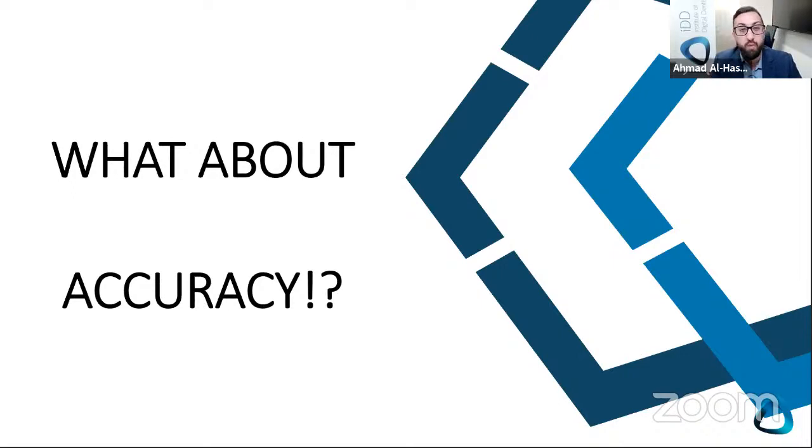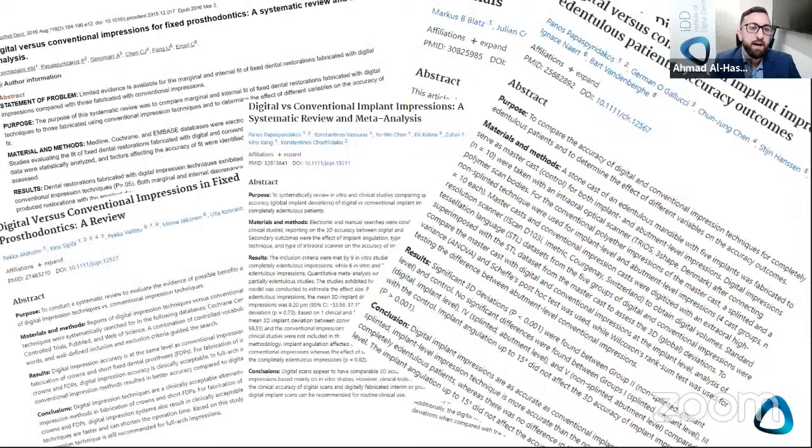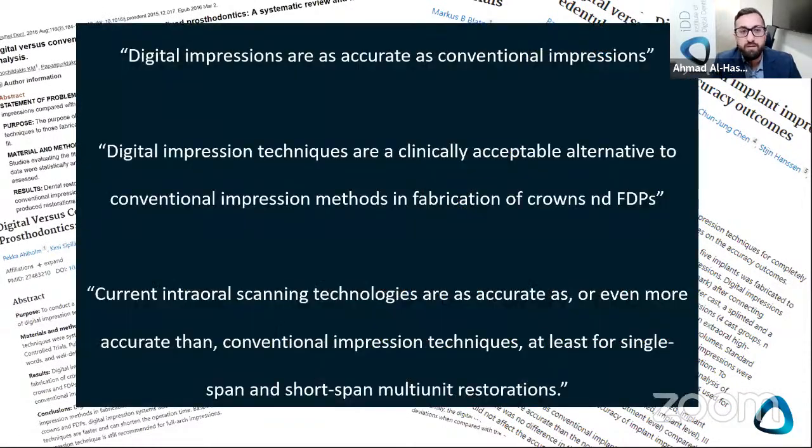A classic one that I always get asked about is accuracy. And the good news is, these scanners have been around for a long time, guys. So now we're getting a lot of research about intraoral scanners, comparing them to impression material. And the research comes to a really easy conclusion: digital impressions are as accurate, if not more accurate, than conventional impressions. And that really makes a lot of sense. That is to say that both are taken well. It's not comparing a bad scan to a good impression. But if a scan is done properly, it is a clinically acceptable alternative to impression material.